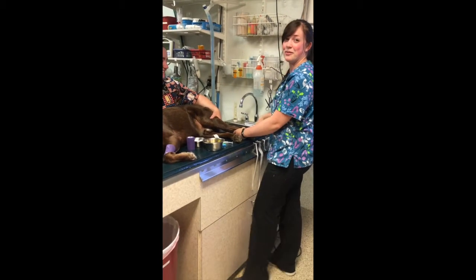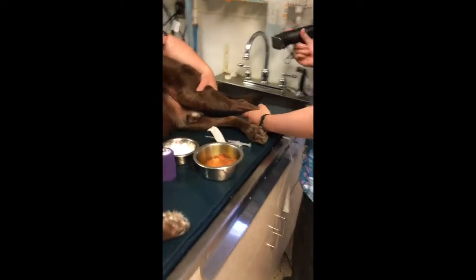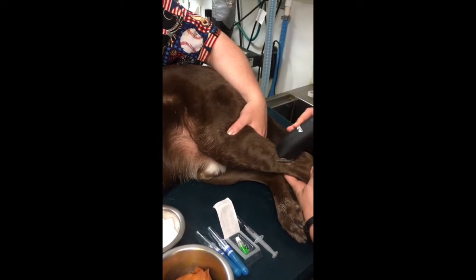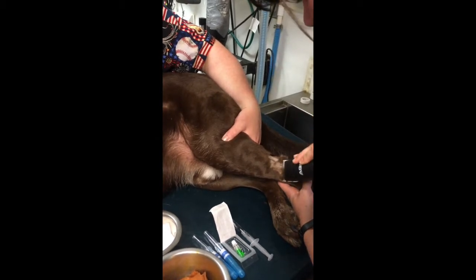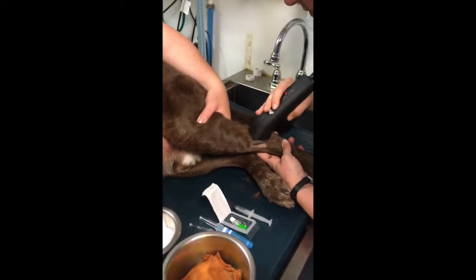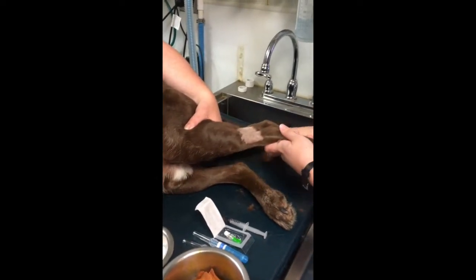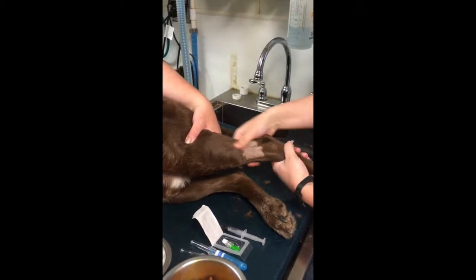All right, this is where we're going to be placing a lateral saphenous catheter on him, so I have everything I need. First, I'm going to go ahead and clip using a size 40 blade. All right, now that I have the site all clipped, I'm going to go ahead and scrub using my betadine and alcohol.